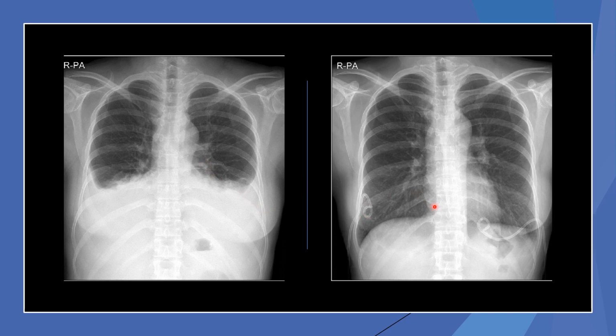And you can see the before and after is just really remarkable. I can imagine how much fluid they took off, because you can hold at least a liter in the bottom of these bases, easy. So they took a couple of liters off of this patient. And now you can see the lungs are fully expanded here, and you've got nice diaphragmatic angles going on right here. But all this area is now open for gas exchange, where before we had very low volumes for gas exchange.